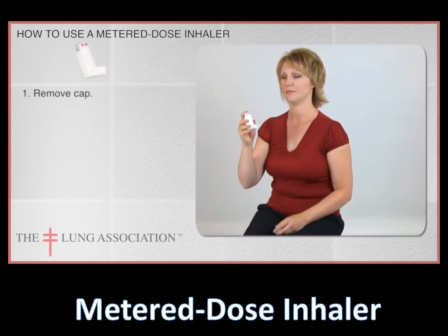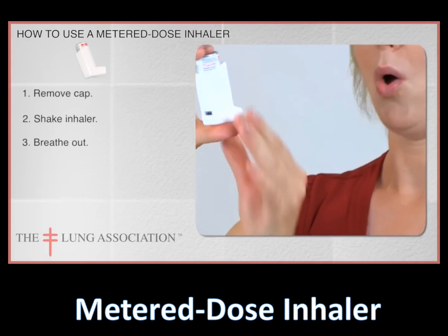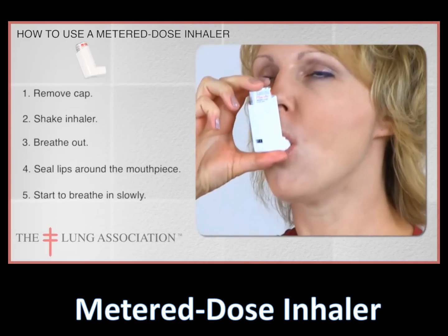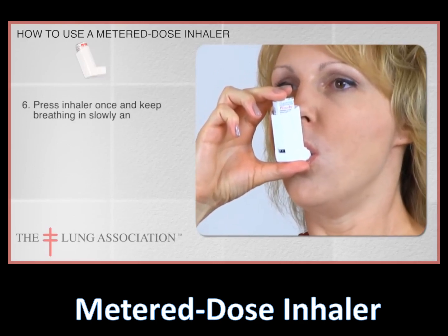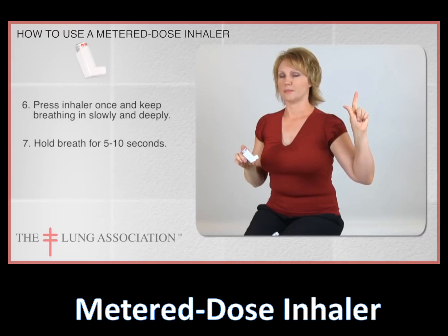Remove the cap. Shake the inhaler. Breathe out. Seal your lips around the mouthpiece and start to breathe in slowly. Press your inhaler once and keep breathing in slow and deep. Remove the mouthpiece and hold your breath for 5 to 10 seconds.